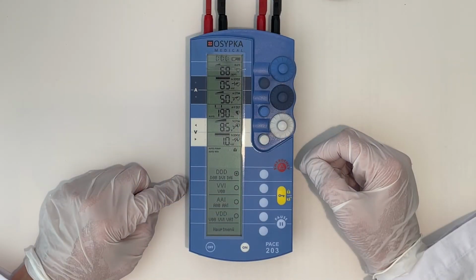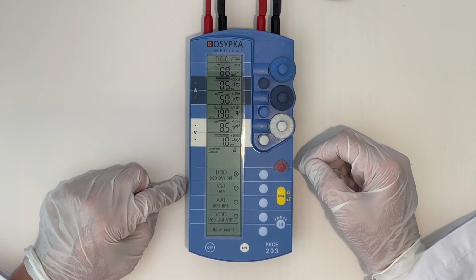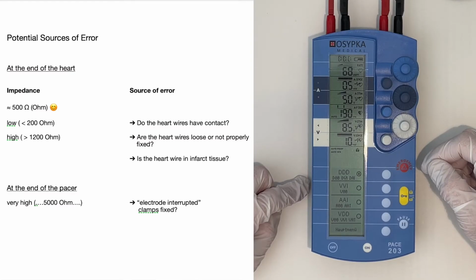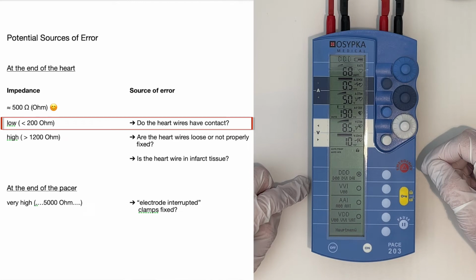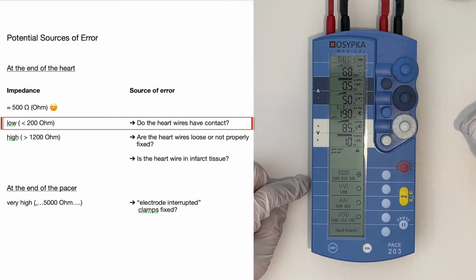Again, the impedance value should ideally be around 500 ohms, because then a good electrical contact to the heart can be expected. Here we show how measured impedance values can indicate possible sources of error. If the impedance is very low, so 200 ohms and lower, then there must be a short circuit somewhere. The heart muscle should be checked to see if the wires could touch each other in any way.